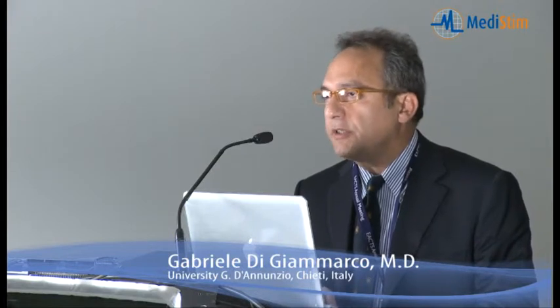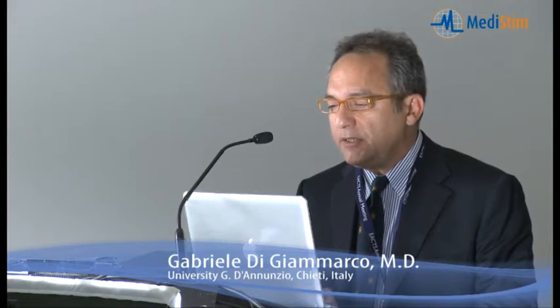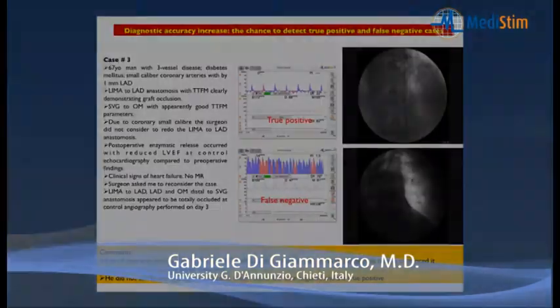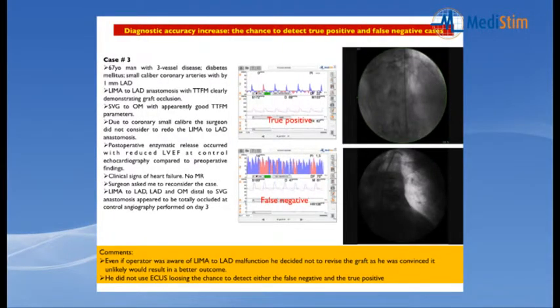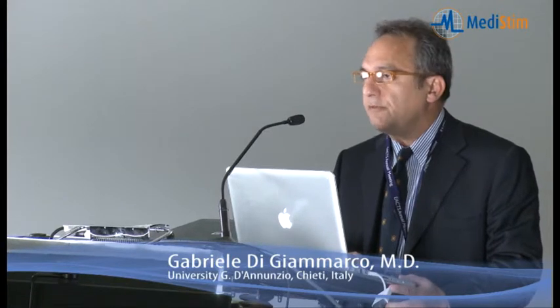The second was a false negative, because we took the angiography, and the LAD was completely occluded, and the LIMA to LAD was occluded proximally, or the flow was back and forth, and the graft was distally occluded to the marginal artery. So the surgeon asked me to reconsider the patient for a redo operation. We did the case, and we found intraoperatively the complete thrombosis of the LIMA to LAD.